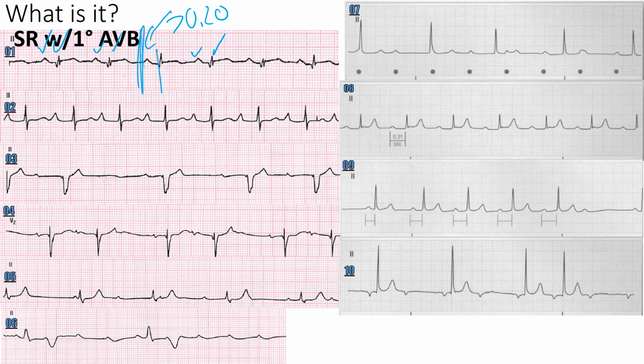So when you submit your EKG worksheet, it is wrong to say just first degree AV block. That is not a complete thing. It's like ordering pizza from the pizza restaurant. It's like, I would like some meatballs. It's like, what do you want? Meatball pizza? You want a supreme? What do you want? Meatball, right? So that doesn't make any sense, right? Or you go to order, say, I want salsa from the taco stop. It's like, salsa. Do you want which carnitas? Do you want carnitas? What do you want, right?